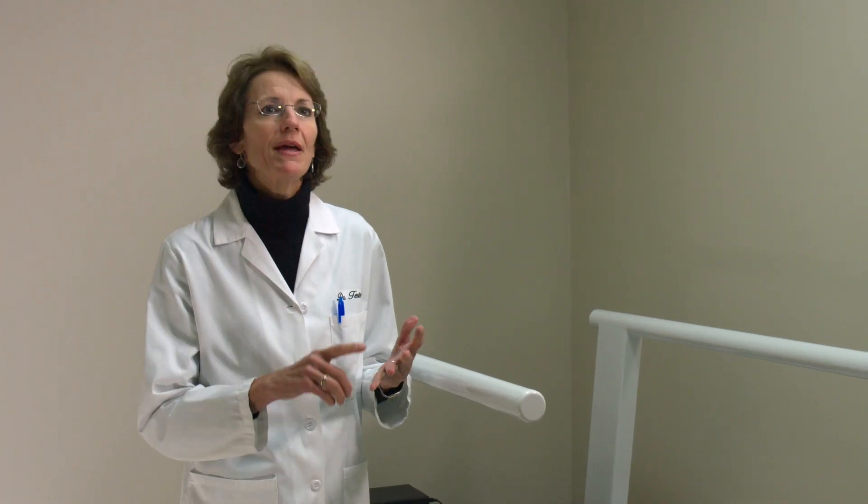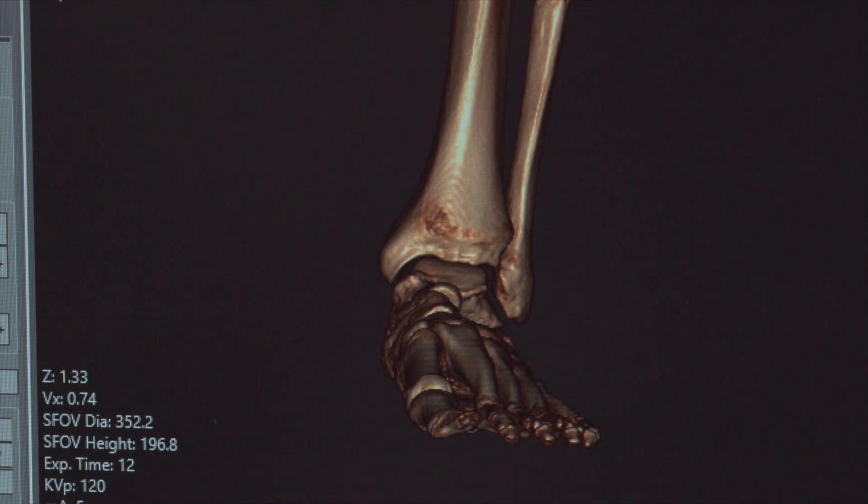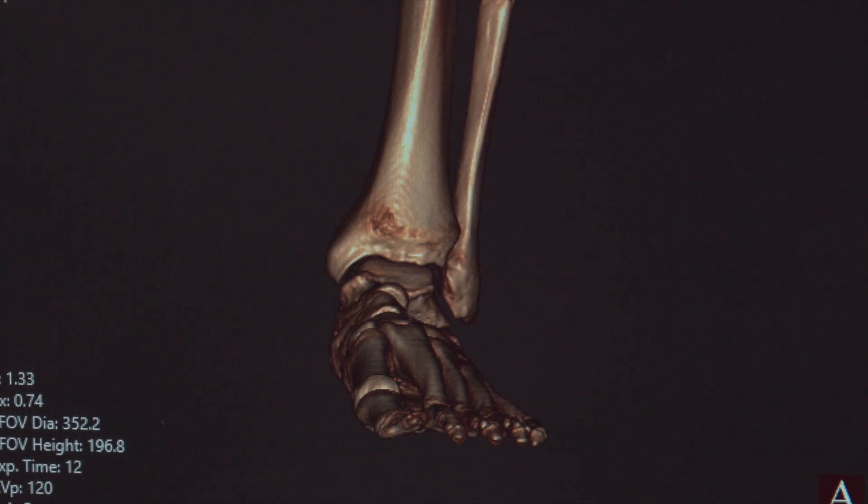So there may be a fracture, there may be an abnormal connection between bones, or there may be some extra bone formation that we're not able to appreciate on plain x-rays. The PedCAT allows us to see that bone in its entirety in multiple planes.